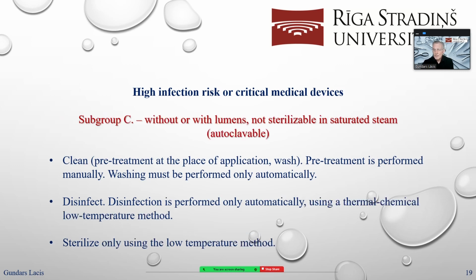Subgroup C, without or with lumens, but it's impossible to sterilize in autoclaves. Cleaning, pre-treatment, the same as always, at the place of application. Washing, and washing must be performed only automatically.